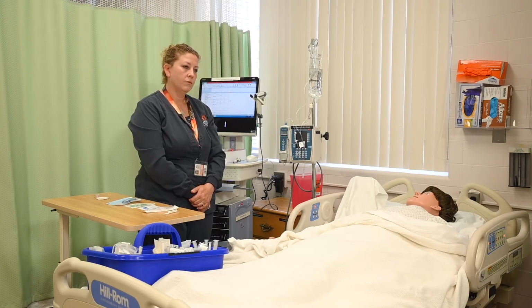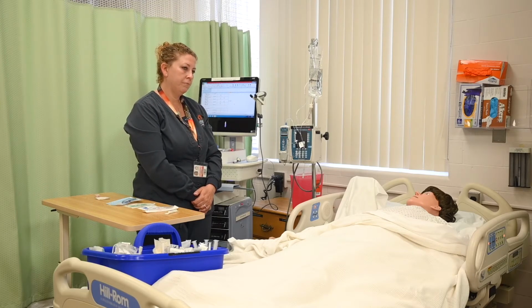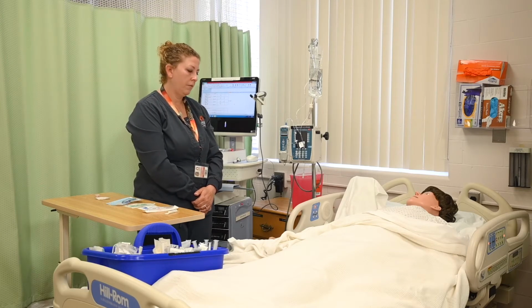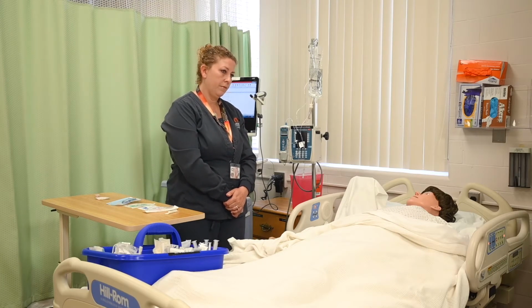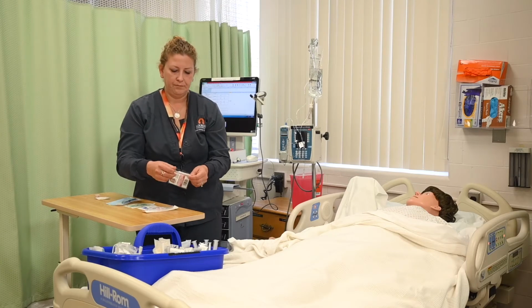If using a tourniquet to identify vein, remove tourniquet temporarily, place the Chuck's pad under the insertion site, and then prepare all equipment, maintaining sterility while preparing supplies. I have a Chuck's pad in place.